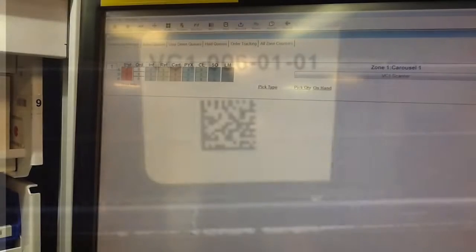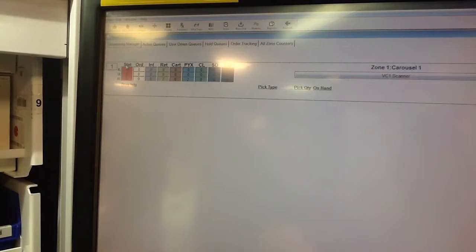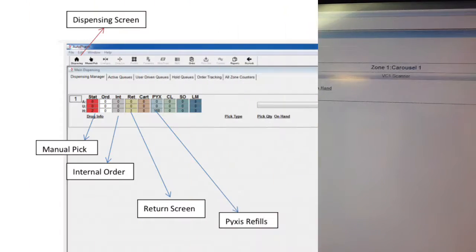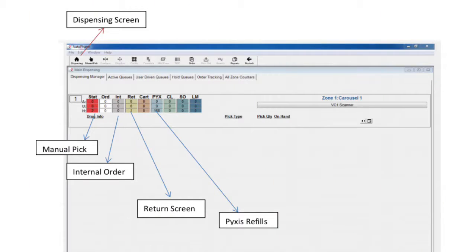Upon logging in, you will see the dispensing screen, which is organized by queue type: manual pick, internal orders, Pixis orders, and returns.